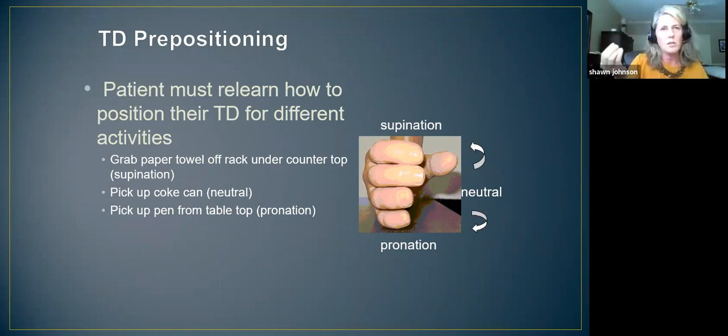So in many situations, whether it's below elbow or above elbow, I will see people twist their midline, twist their waist to go do that activity rather than try to rotate the hand or the terminal device into the appropriate position. So it's something that needs to be taught to many people.